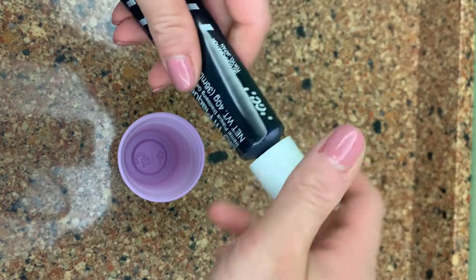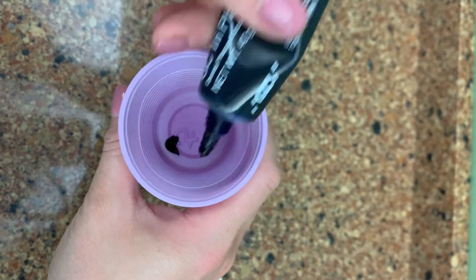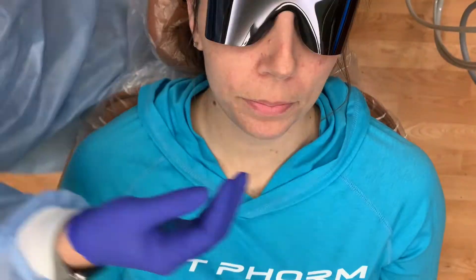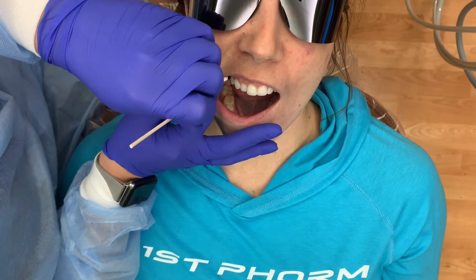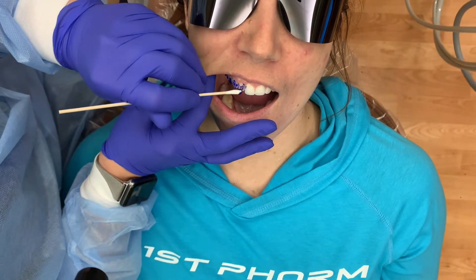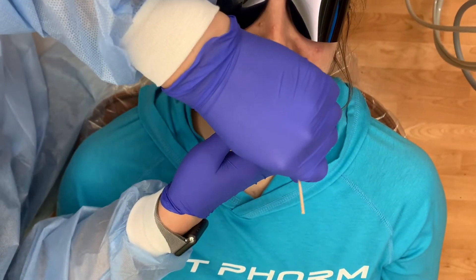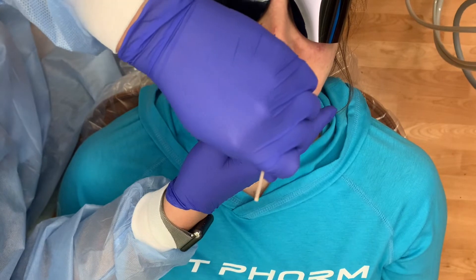Dispense gel into a dish or cup to apply to multiple tooth surfaces. Apply the gel onto the tooth surfaces using a suitable instrument such as a micro brush, swab, or toothbrush. Be cautious not to get the gel on the patient's lips, face, or restorations.